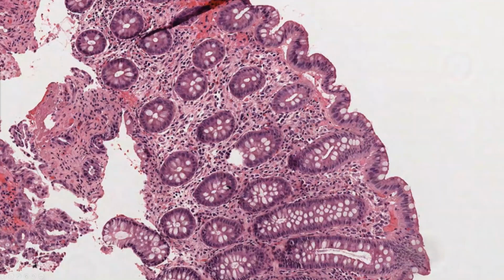Okay, so I will move now to the close-up of this. This is one of the fragments that showed the biopsy looks okay on the surface. The crypt architecture is well maintained here, except in some fragments at the base, where the crypt looks a little bit diseased, but overall the inflammatory cell infiltrate is not particularly increased or decreased in this area.